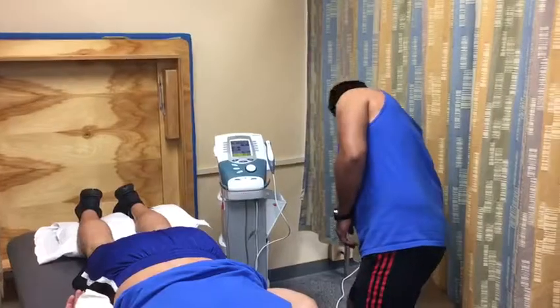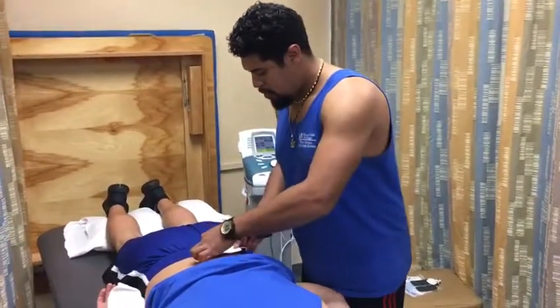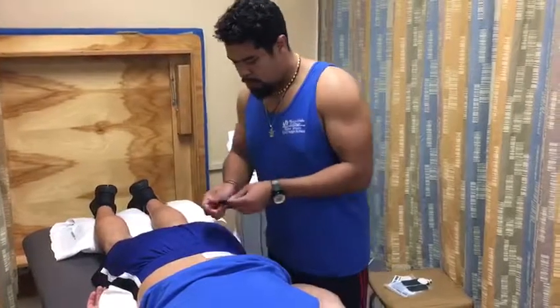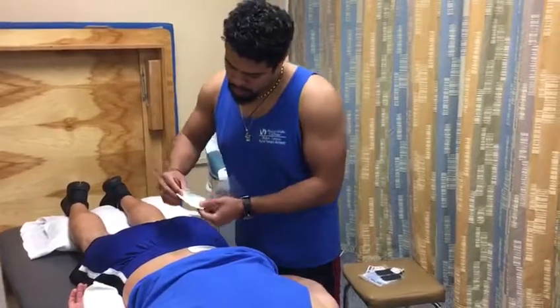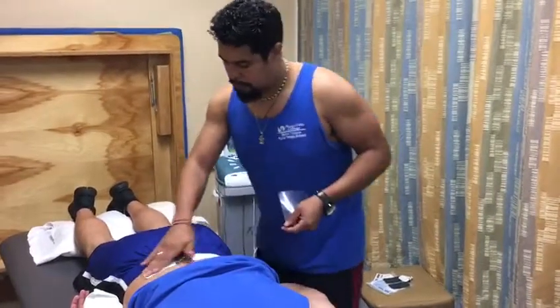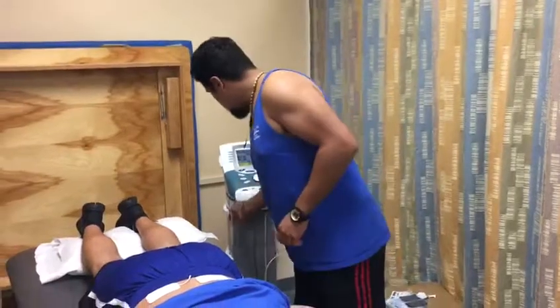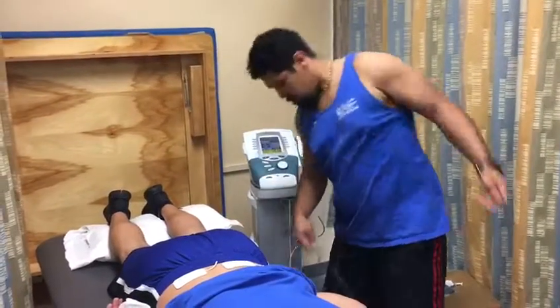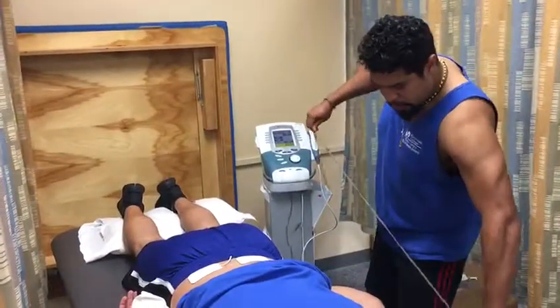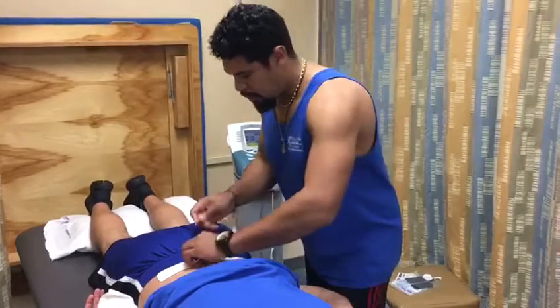We place the electrodes. Right. One more spine. Okay. Then we place the wires. Okay, the leads are in.